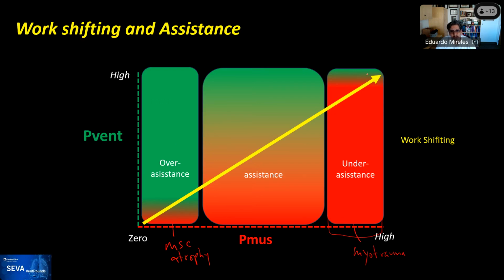And you can start imagining that, regarding the mode, there are modes that cause this more than others. That's our classic graph, where the support, the P-vent, goes down as the patient does more effort. And that's our volume control CMV, or the adaptive modes, or adaptive targeting, which is PC-CMV A or CSV A, sorry, CSVA.